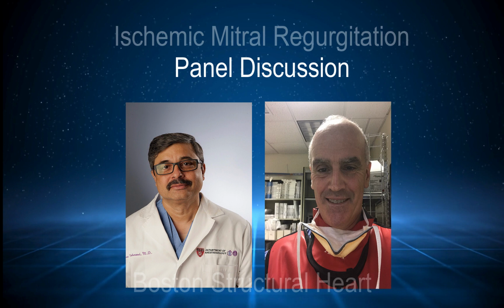So right away, I wouldn't be planning on mitral valve surgery at that time, unless you told me prior to going to the operating room, prior to going to sleep, you did a quick transthoracic and he had moderate plus mitral regurgitation in pre-op. The point I'm trying to ask, Andy, is that normally general anesthesia is associated with underestimation of mitral regurgitation. If it's more than what was reported, then obviously it's very significant then. Right. And so hence why I'm talking more about the pre-induction examination and evaluation.